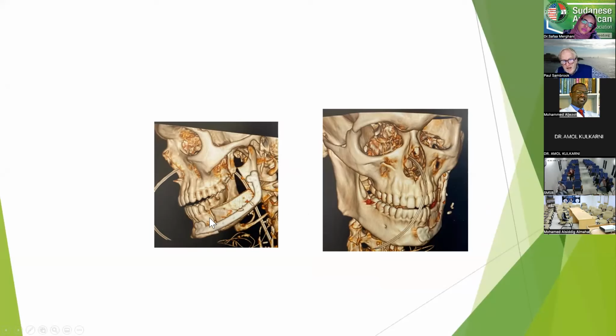And this is one where we are now placing dental implants into the graft before it's been removed from the hip. So we can plan implants into these sorts of transplants in order to reduce the number of surgical procedures that these patients undergo. And oftentimes these people have procedure fatigue. They will have their cancer resected, they will have their reconstruction, they will have their radiotherapy, they will have all sorts of things. By the time you come to try and reconstruct their dentition, they've had enough of you.